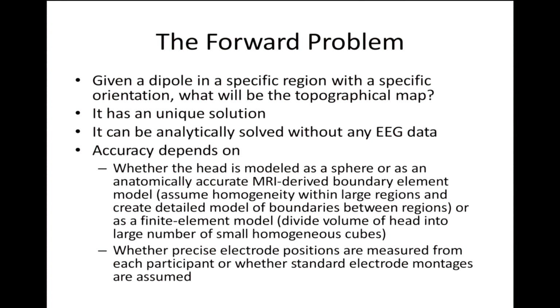So, that is the forward model. Suppose you are doing a motor task, you put a dipole in the motor cortex, premotor cortex, and based on previous literature, you put it at a very specific location with a specific orientation. After you solve these equations, the forward model gives you what the EEG would be if someone records from the scalp, given there is only one source in the brain. This estimation would be better if you have the MR image of the individual participant.